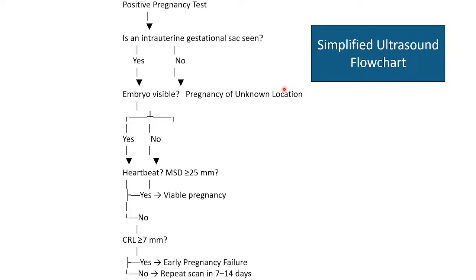The other mistake that most of these people make is that they come to the department without a pregnancy test. So it's not good for the referring clinic to just send a patient without testing the pregnancy. It's a protocol. They have to do that, so that if they come with a pregnancy result saying they tested positive, then you start from there. Then these are the questions that you are going to answer with the ultrasound.